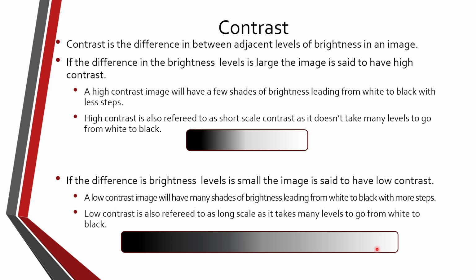So we have white, we have many grays, many different ones. We get to darker grays, darker grays, darker grays, and then we're into the blacks, well, what we would view as being black. It's just darker grays, and white's just lighter grays, right? But we would call them white and black, right? So we'll go ahead and continue talking about contrast.